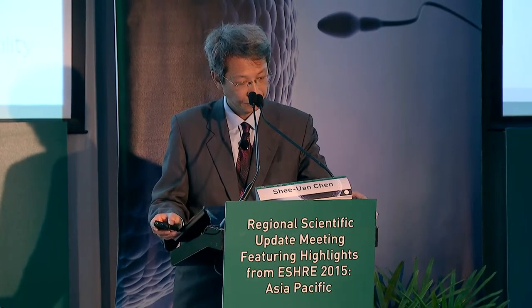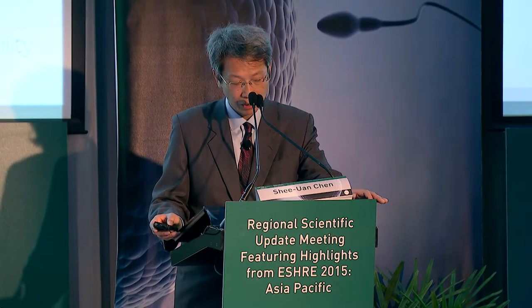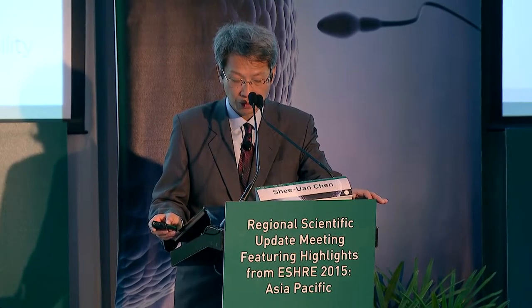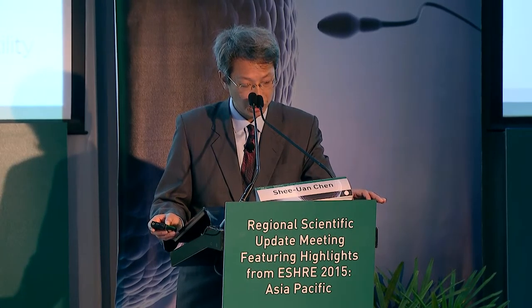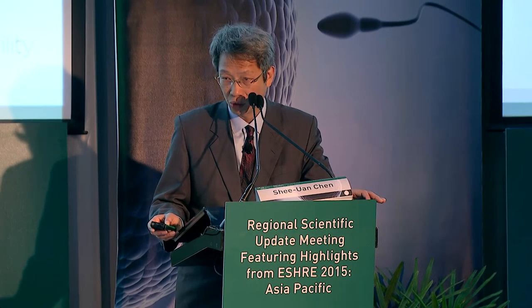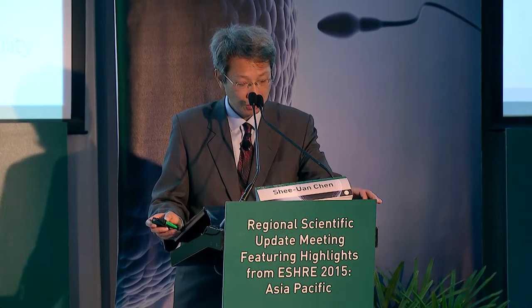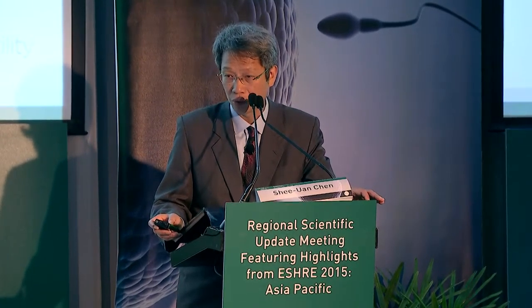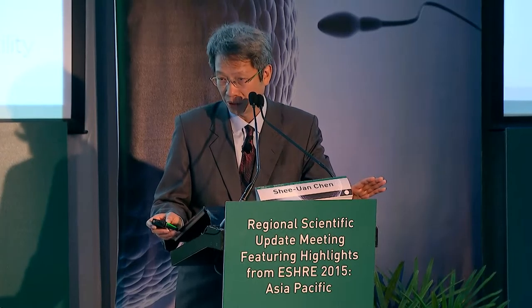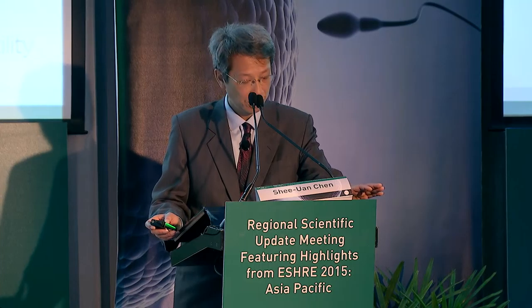The summary. The first talk: given the clear benefits of frozen embryo transfer versus fresh embryo transfer, clinicians should consider a freeze-all strategy for the majority of patients in their clinics. Multinucleated embryos may have a good implantation potential and there are also case reports of live births. Especially we can culture to blastocyst then freeze. It's useful.